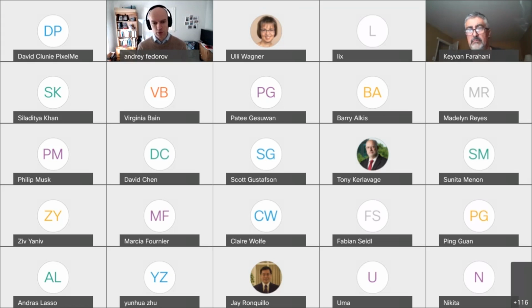So it is an open question and came up with some of the users already. Can we open a DICOM web interface for accessing the data? Right now we cannot, but if there is a significant push from the community and we have a number of use cases, then we definitely should reconsider and bring this up also to our partners at Google Cloud Healthcare. So that's like a technical point, but I wanted to mention this.